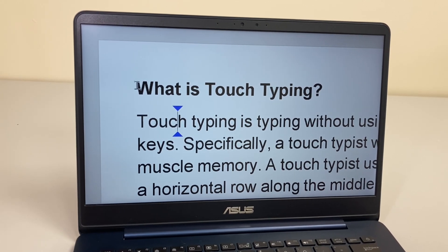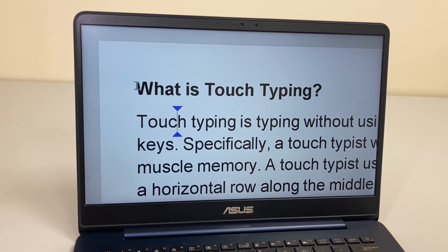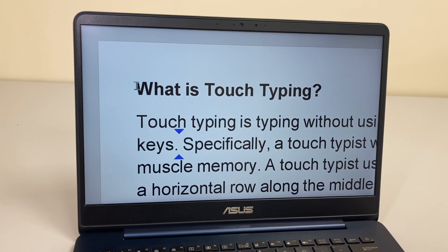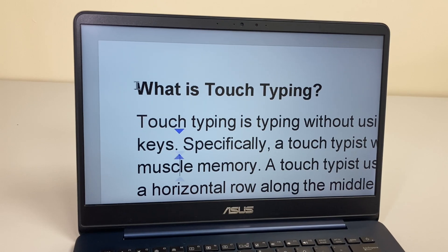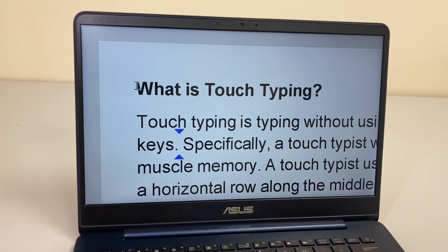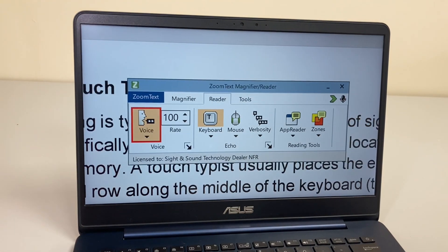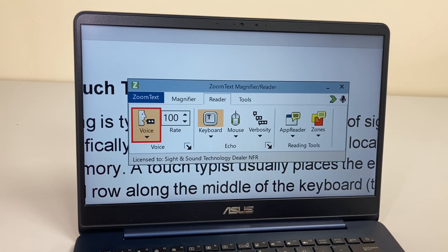The document reads: 'Touch typing is typing without using the sense of sight to find the keys. Specifically, a touch typist will know their location through muscle memory.' We can stop the reading with the Control key, but if I go back to my settings under Reader.